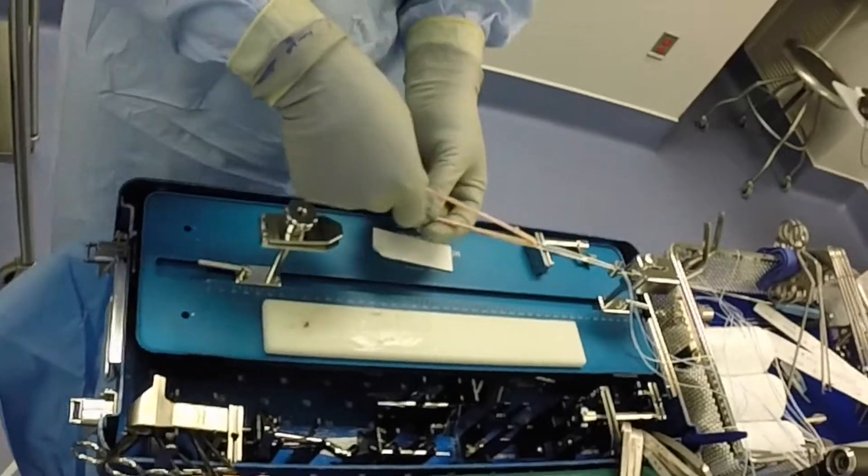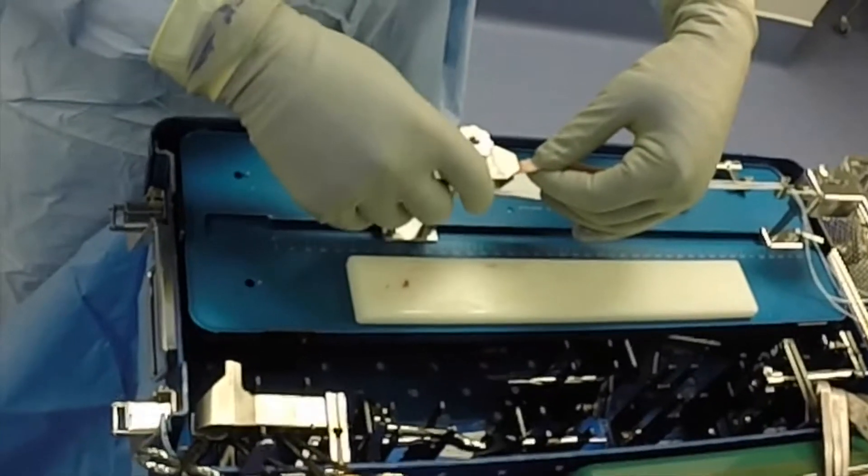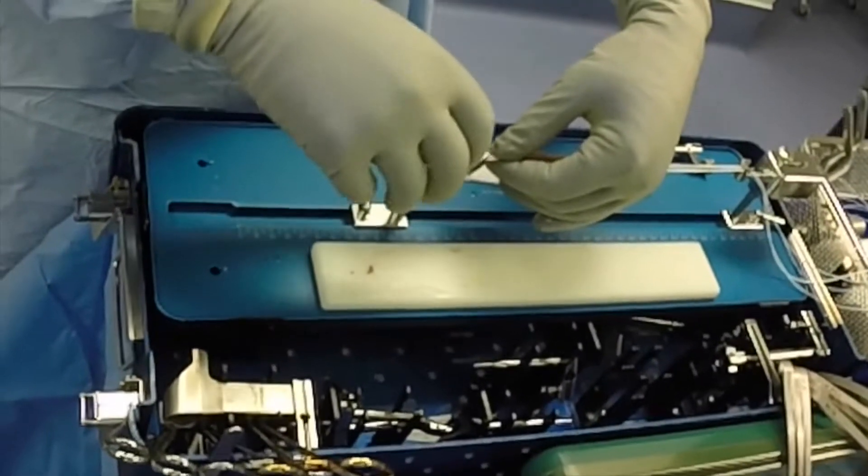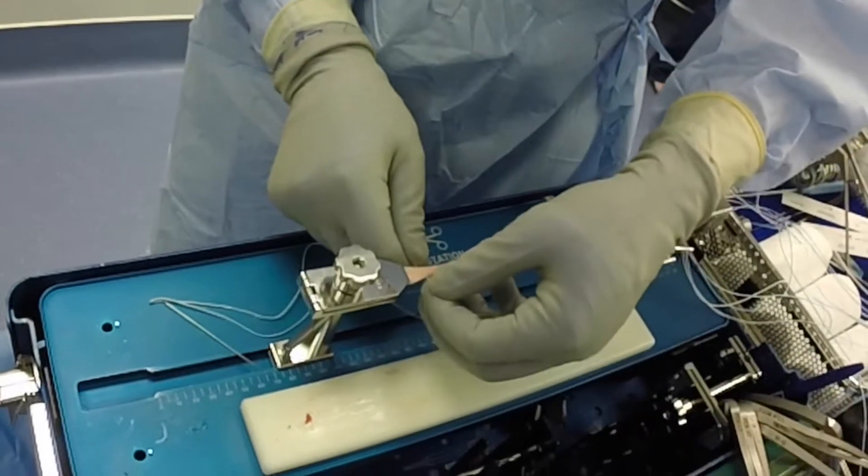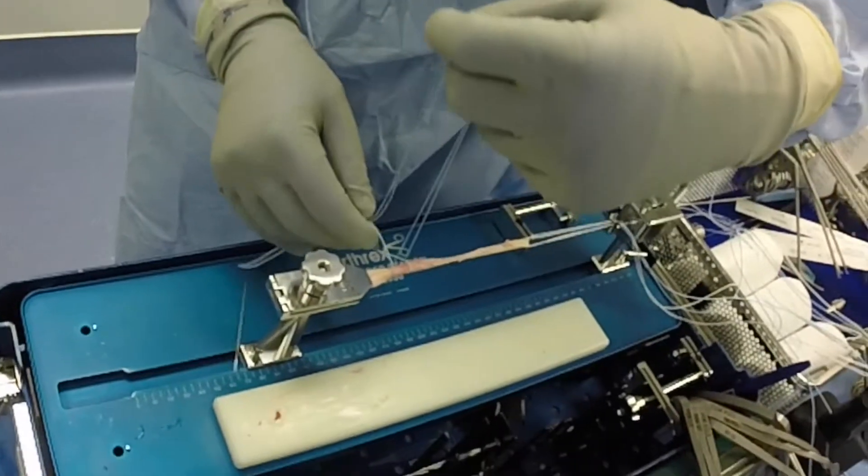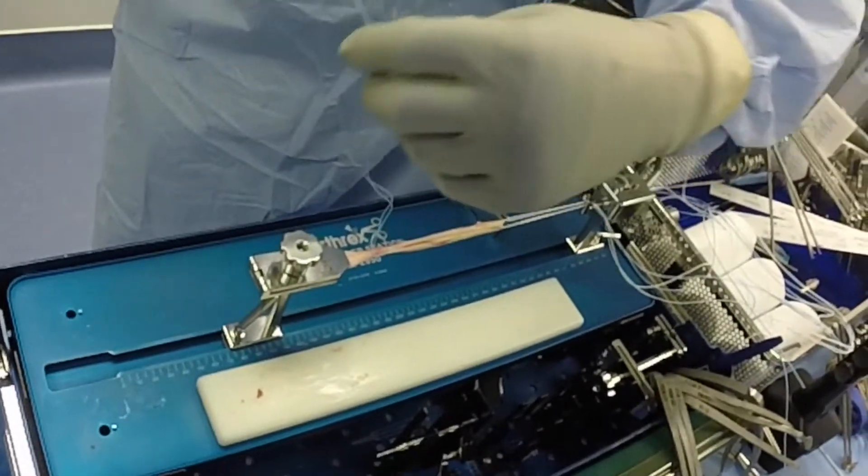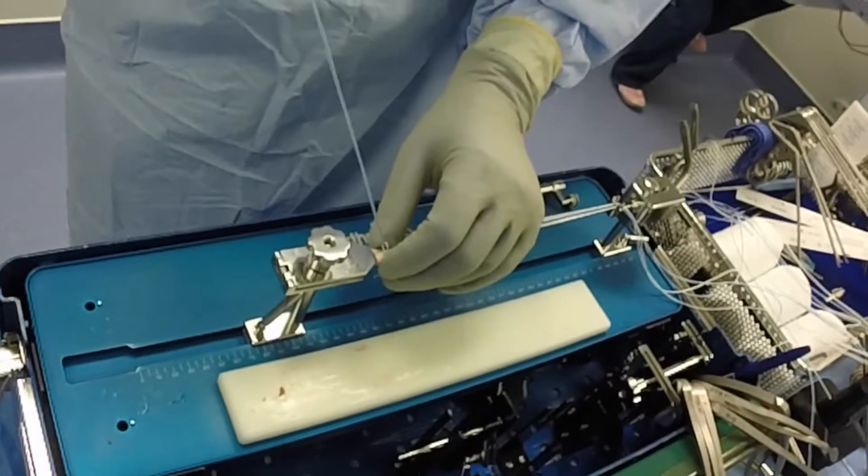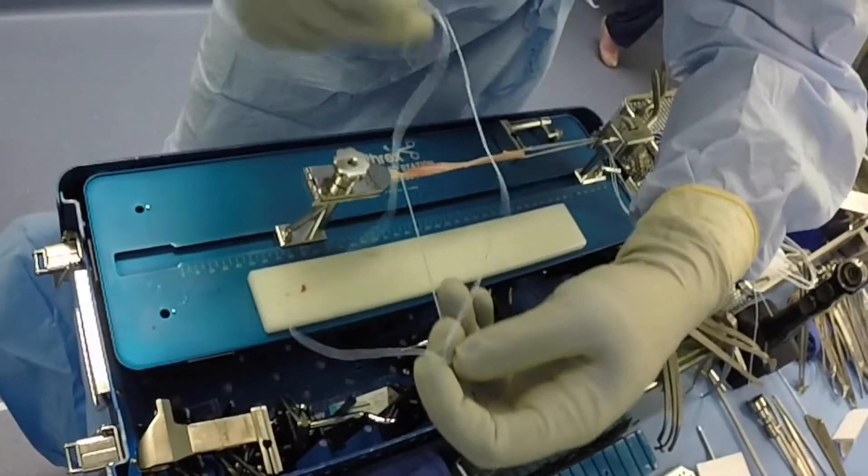The graft is then doubled over through the tibial side TightRope and secured to the graft station. A fiber loop suture is then passed around the doubled-over tendon on the side away from the TightRope and cinched in place.